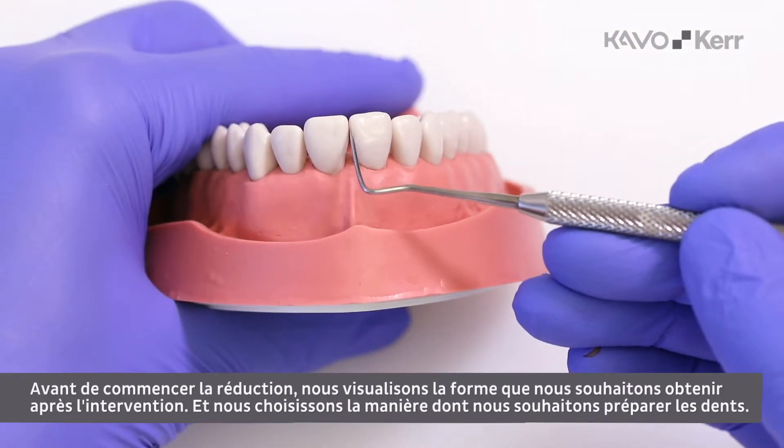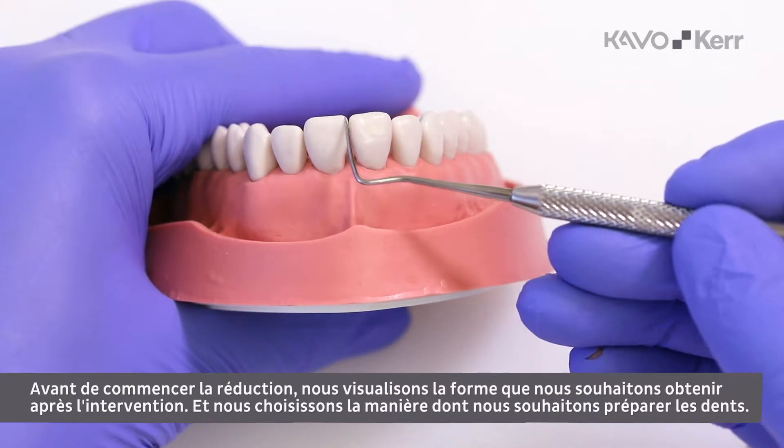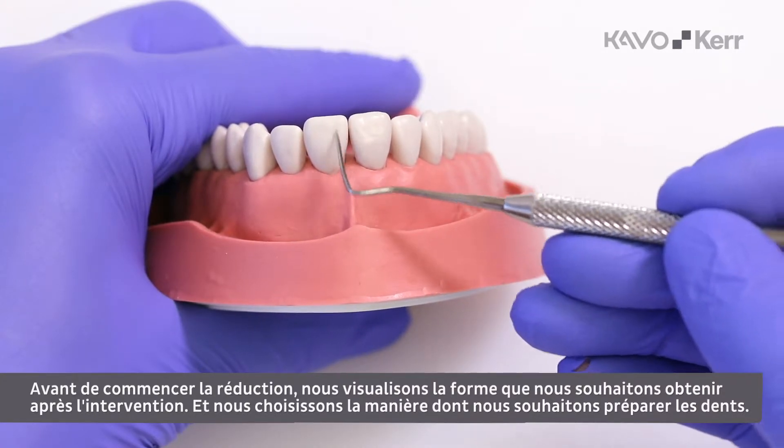Before we start the IPR, we visualize the preferred tooth shape after the procedure and decide how we want to prepare the teeth.